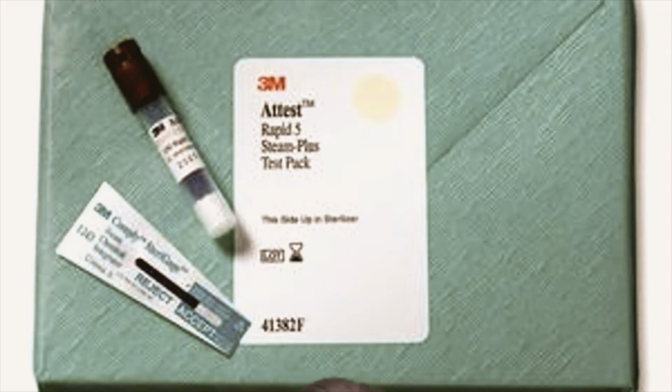On this chemical indicator, look and see that it says reject and accept. So if the chemical strip fills up into the accept range, then this is to be accepted by the user. And it takes 4 minutes to do this.